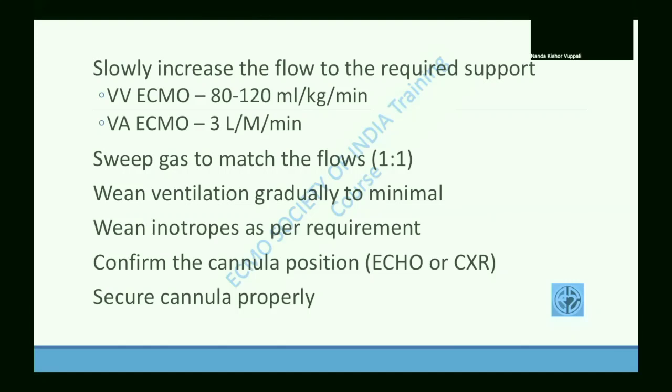When the patient goes on ECMO and stabilizes, he would not need high pressure ventilation. So you usually back down the ventilator to minimal settings. The aim is to keep the lungs open while not causing much injury to the lungs.